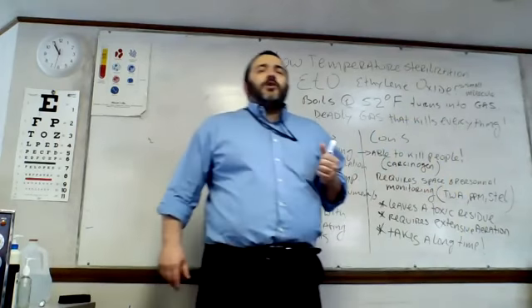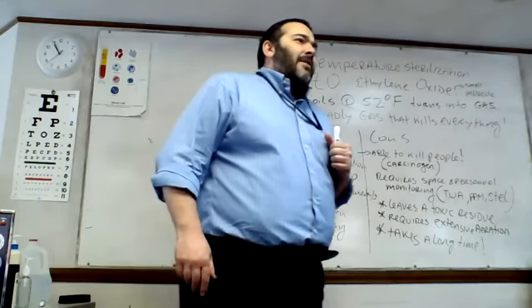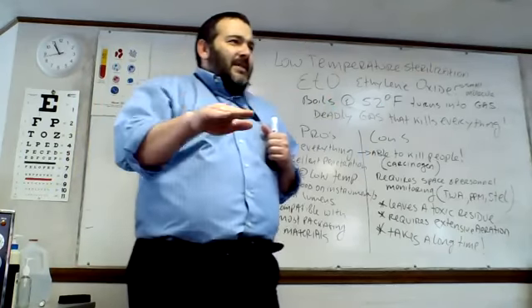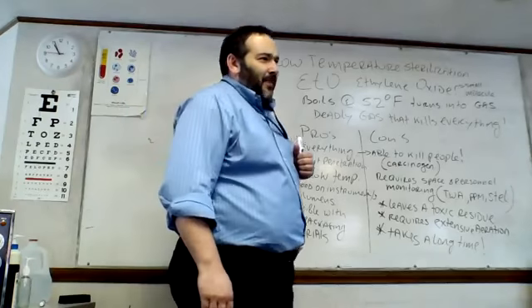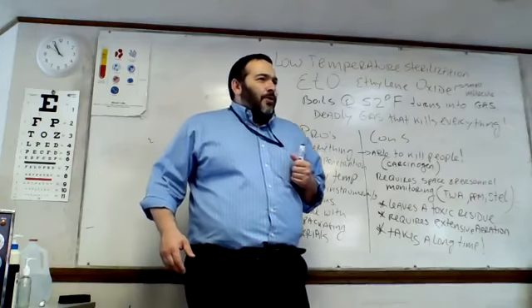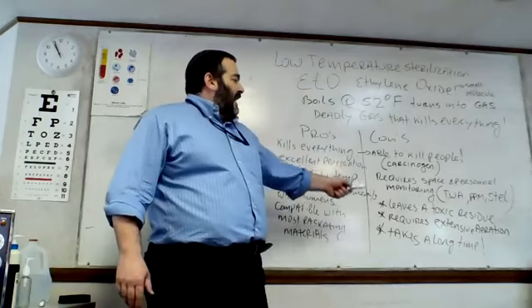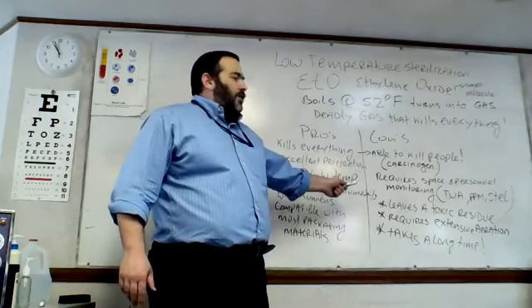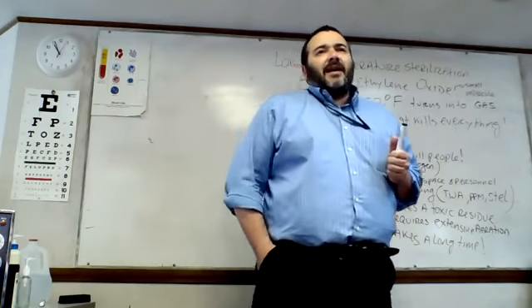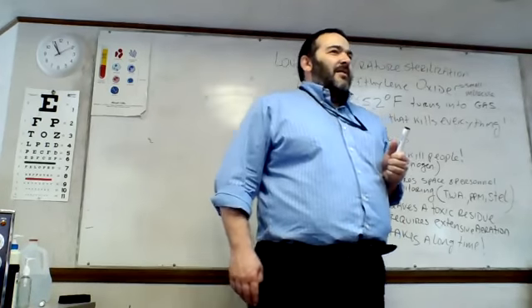And in this particular case, you can reduce your cycle of aeration a little by changing the temperature. If you increase the temperature just a little bit, it drops the aeration time significantly. Okay? The sooner you turn it into a gas, the sooner it'll be ready for you. So one of the drawbacks: takes a really long time, requires extensive aeration, leaves a toxic residue. And by the way, if it leaves a toxic residue on the instrument, who does that impact? If you didn't aerate things properly, the patient.